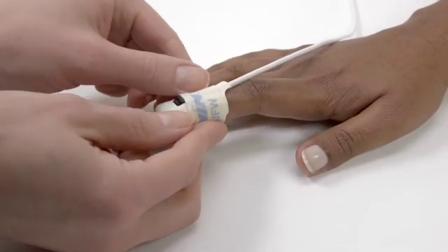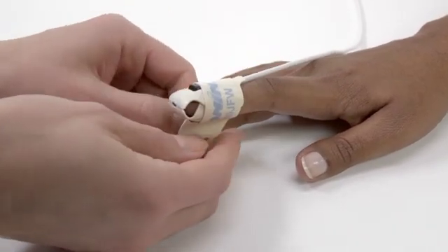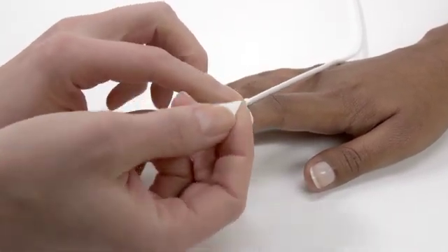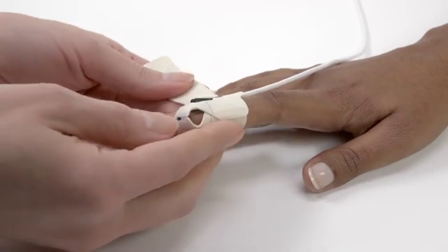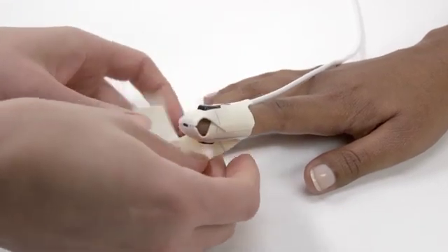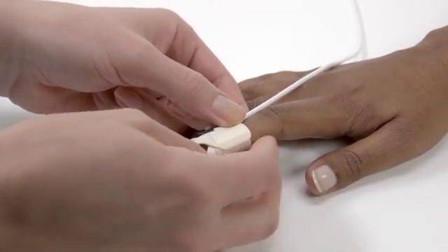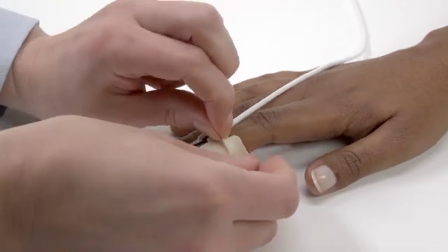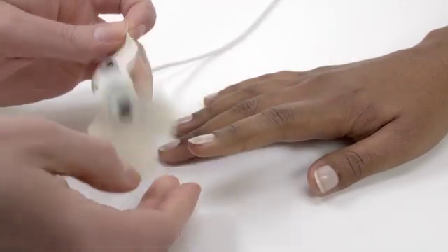To remove the sensor, simply disconnect from the oximeter and reverse the direction of the tab wrap to gently remove from the finger. The same wrap may be reused on the same patient as long as the adhesive is intact. For a new patient, a new FlexiWrap must be used.